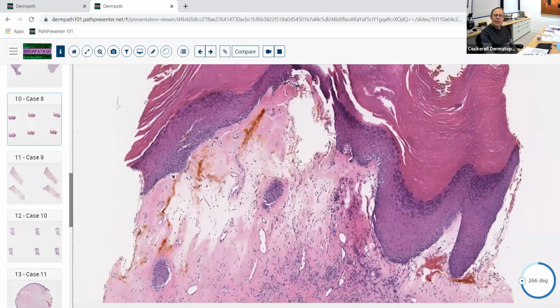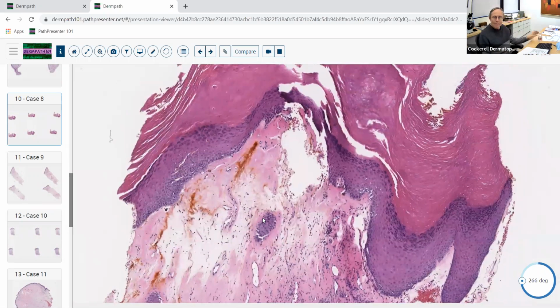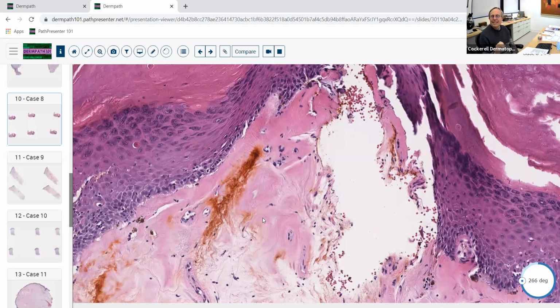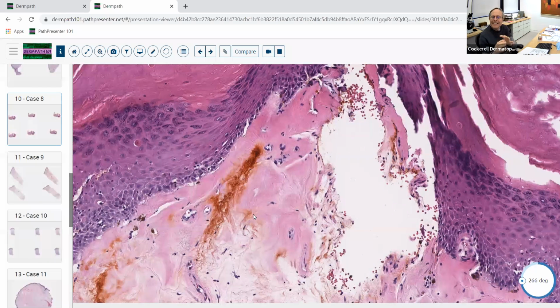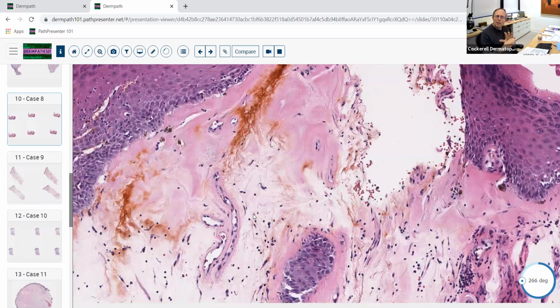And when we get this sclerotic change of the papillary dermis, it looks a little bit different than the sclerotic change we see in the reticular dermis. It gets this almost delicate, gossamer, bubblegum pink sort of color to it, with this whitish discoloration that goes along with it, which is the edema of the papillary dermis. So we get sclerosis of the papillary dermis, which gives you this more fine pink color as opposed to that thick, homogenized collagen bundles. It's the type 1 and type 3 collagen bundles in the dermis that become homogenized.